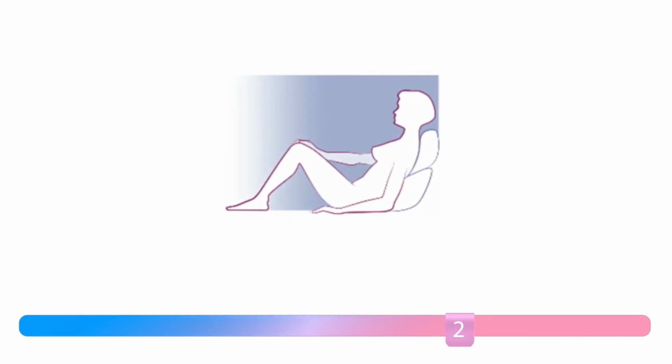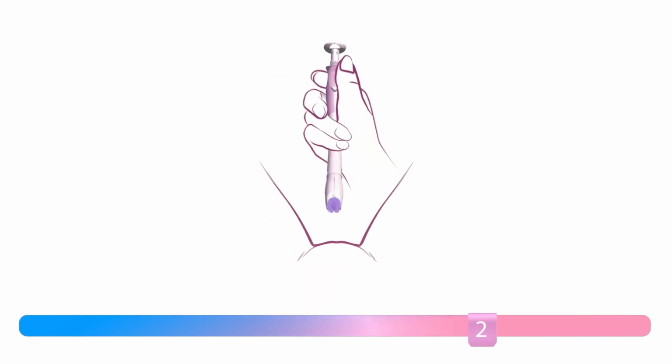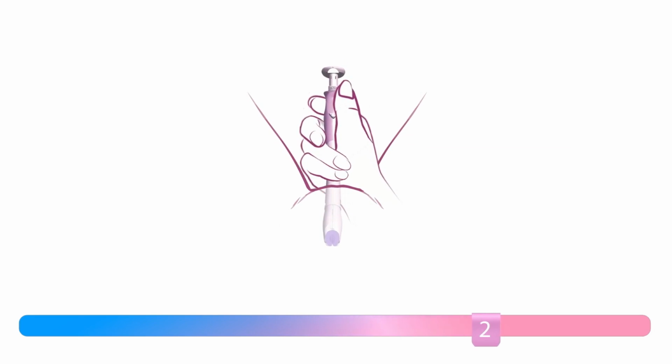Step 2. Insertion is best done in a reclining, supine position as shown. Use pillows for support. Make yourself comfortable. Holding the applicator as shown and using no lubricant, introduce it into the vaginal tract, sliding gently until the tip reaches the cervix and you can no longer advance.